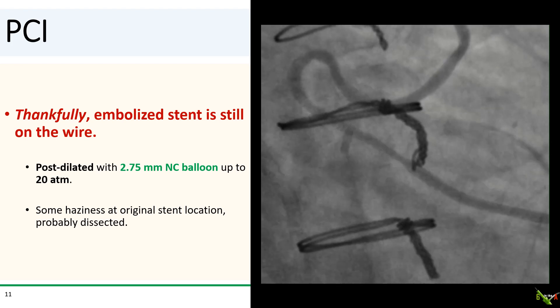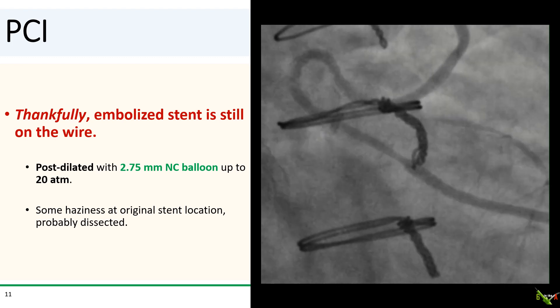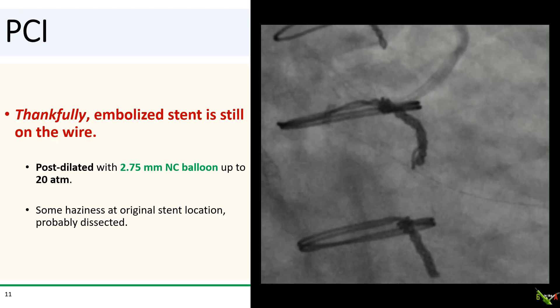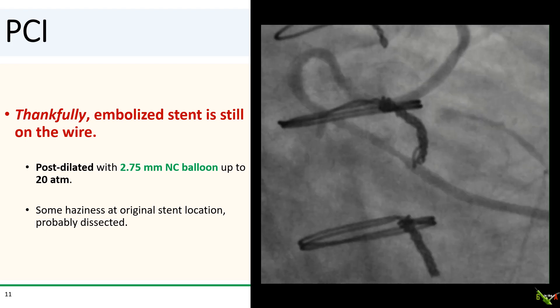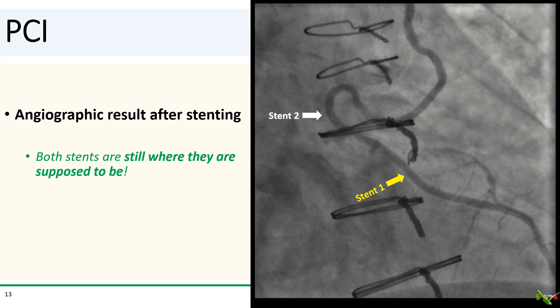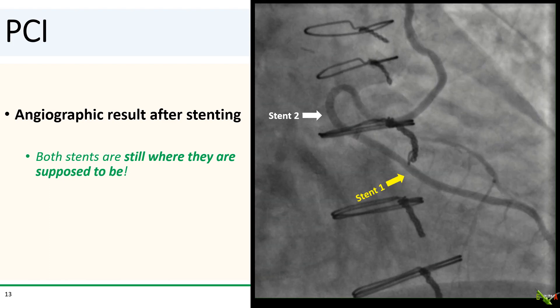After you pick up your jaw from the floor, you realize that most fortunately the embolized stent is still safely on your wire and still in a reasonably good location to deploy. You reach for a 2.75 millimeter NC balloon and post-dilate it at very high pressure to make sure it now stays in place. There is some haziness at the original location of the stent, probably reflecting a small dissection. The original stent location was then restented with a 3.0 by 18 millimeter DES, which was intentionally oversized a little bit. Here is the angiographic result after stenting — there was good flow and most reassuringly, both stents are still where they are supposed to be.